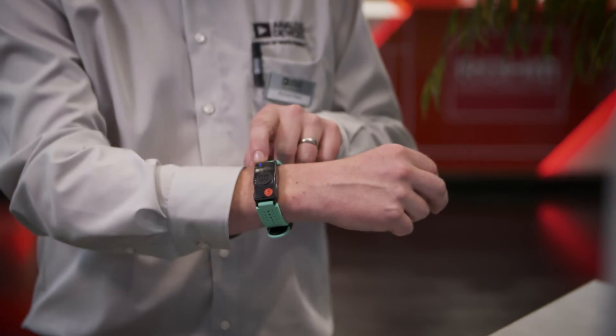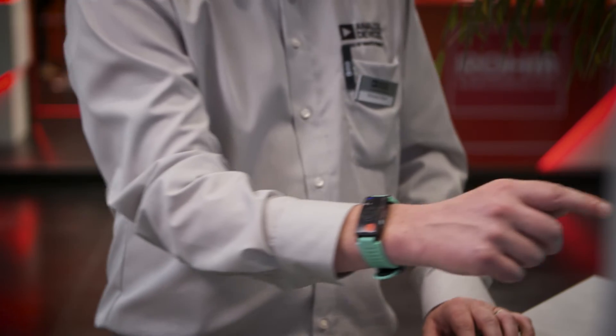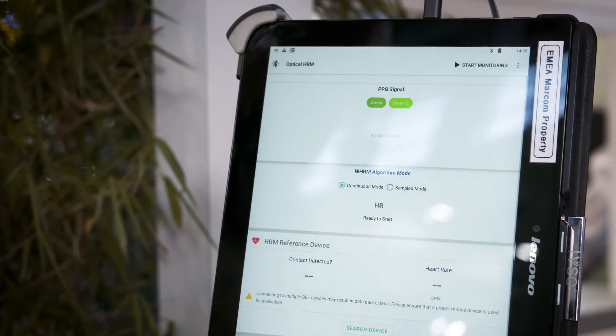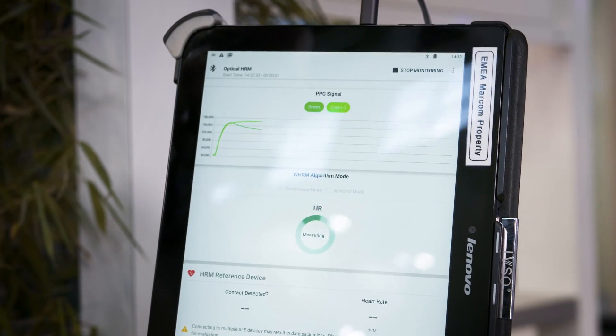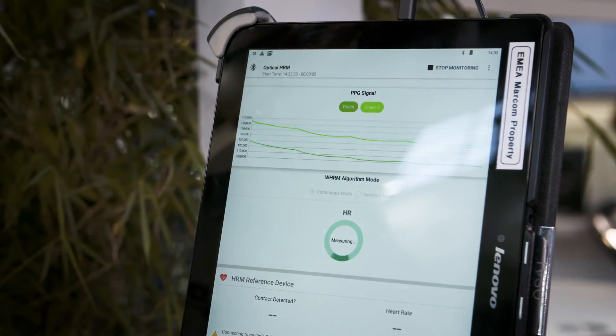So now we're going to demonstrate how the Analog Devices app works. First of all, make sure it's connected — you know this by the blue LED showing on the watch — so it's ready to go. Now I'm just going to select the optical heart rate measurement, press start monitoring, and we can instantly see the PPG signals reading on the two green LEDs.